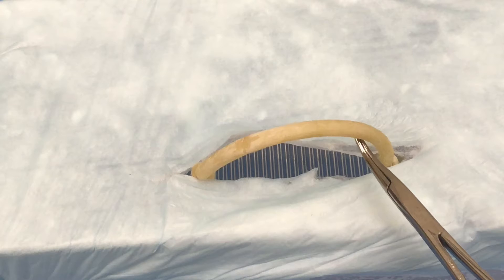This is a demonstration on how to do a modified three-clamp technique on an ovarian pedicle model. What you can see here is the ovary and this is going to be the uterine horn.